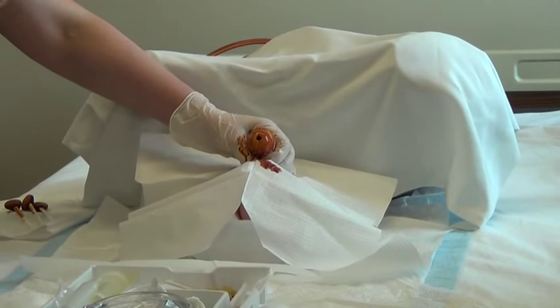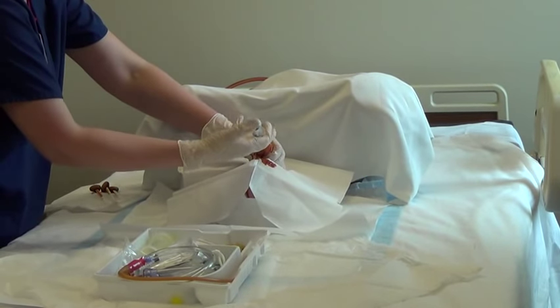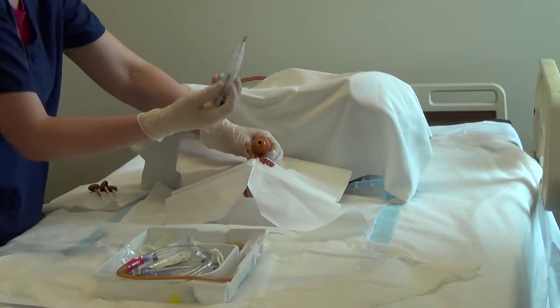You then inject the Urijet at this time. The function of the Urijet during insertion is not necessarily to numb the area, but rather to dilate and lubricate the urethra.